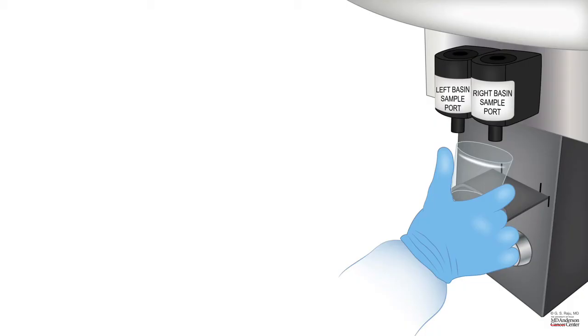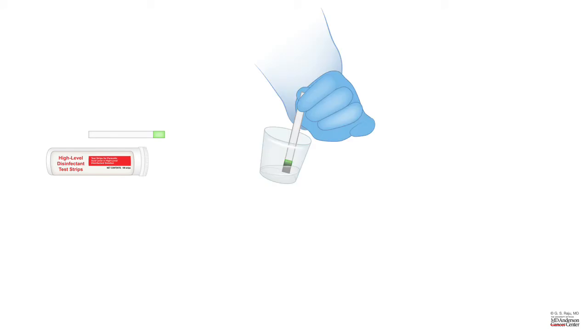You collect the solution depending upon whether the scope is on the right side or the left side of the machine from that particular bin, and use a test strip and dip it in the solution that you collected from the bin and check whether it is a pass or a fail. If it is a pass, then the cycle of disinfection can go on. If it were to be a fail, then you should completely fill up with a new batch of disinfectant solution and restart the process.